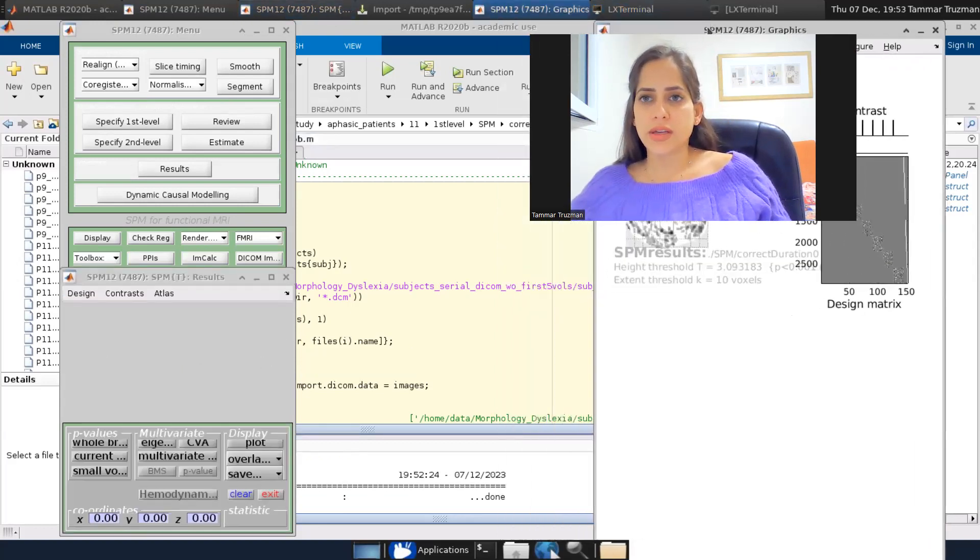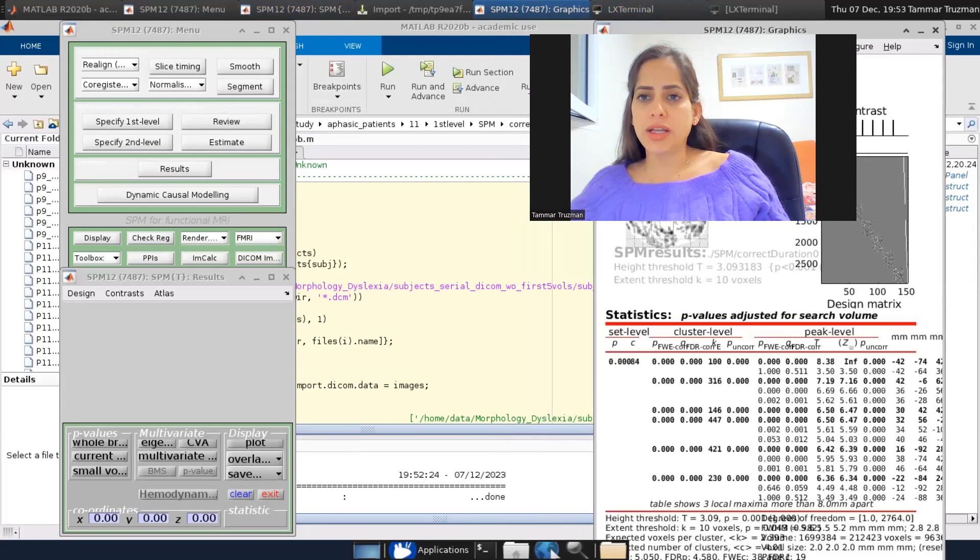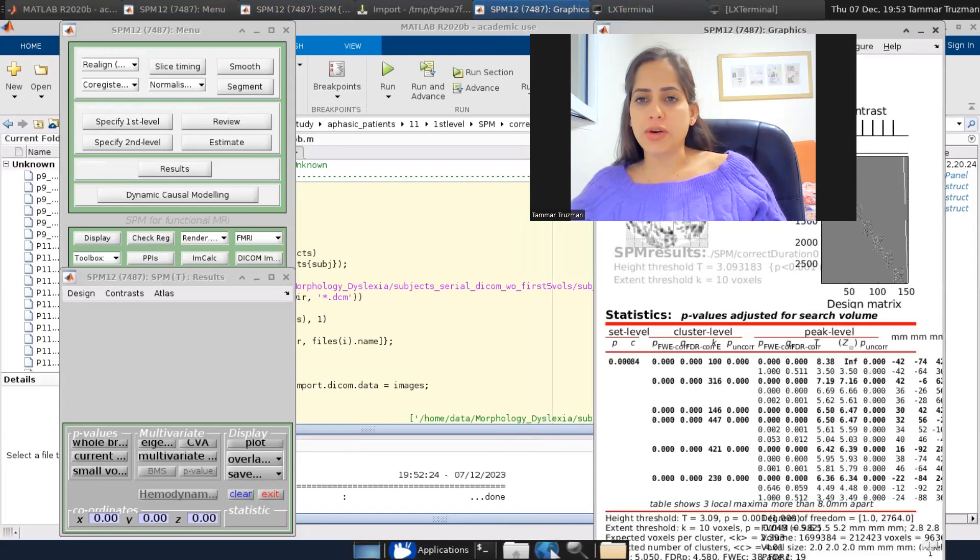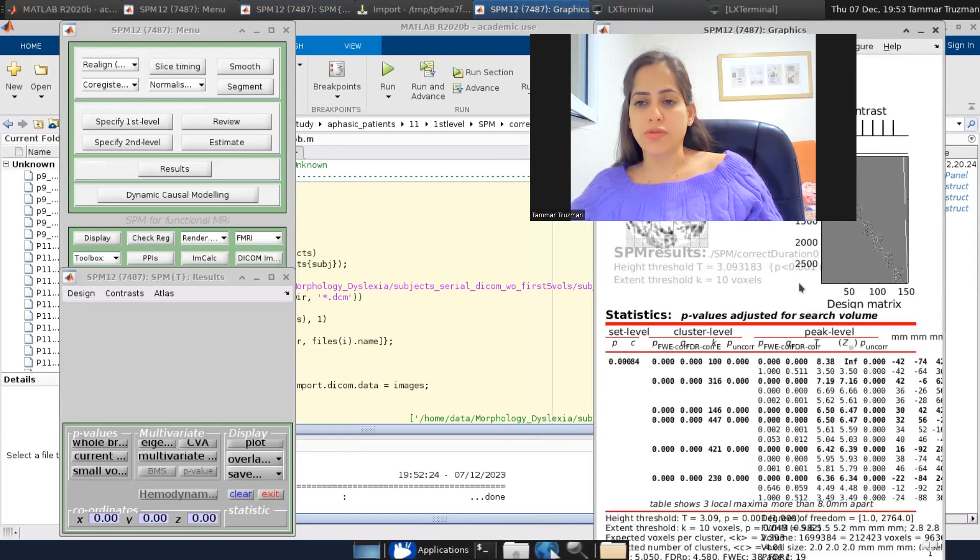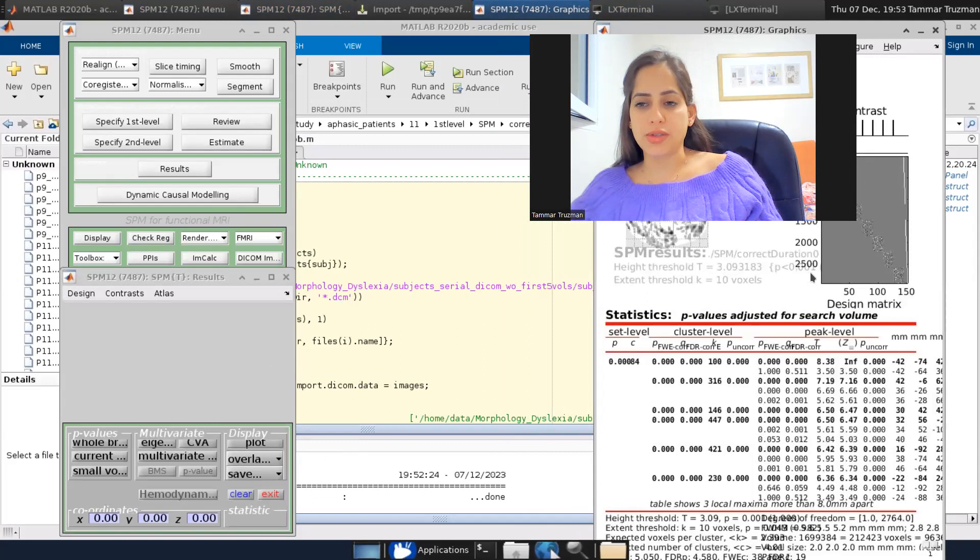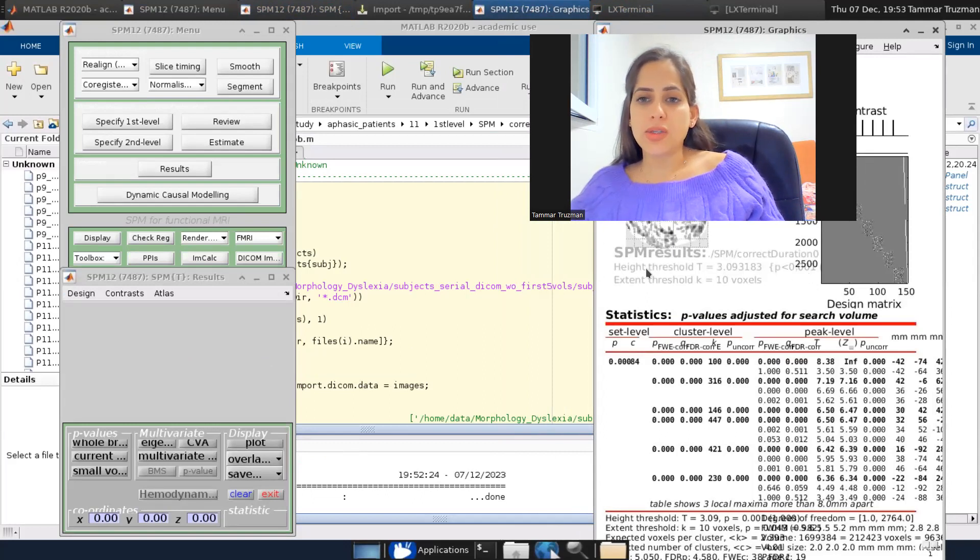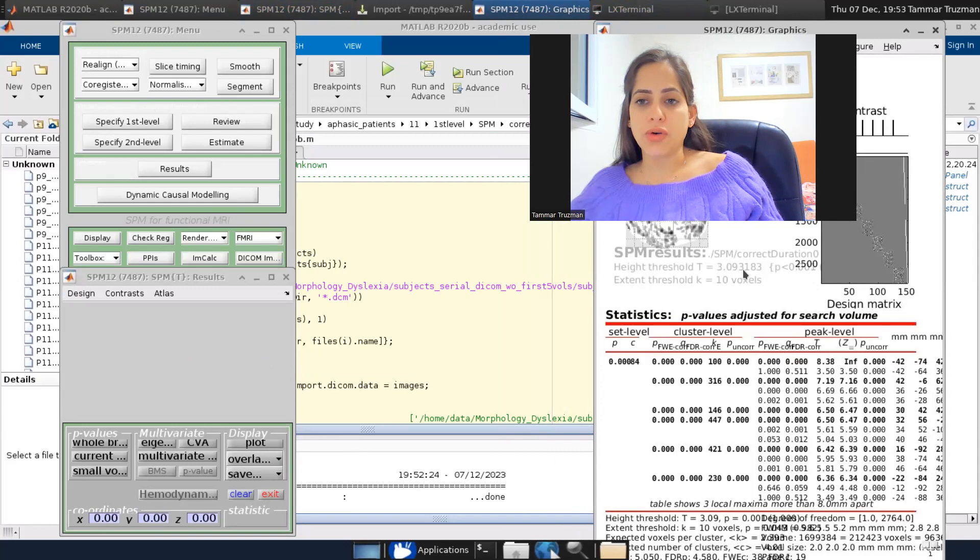So let's look at the results. We have the glass brain with all the voxels that pass this threshold of uncorrected p 0.001, and it equals to a high threshold T equals 3.09.